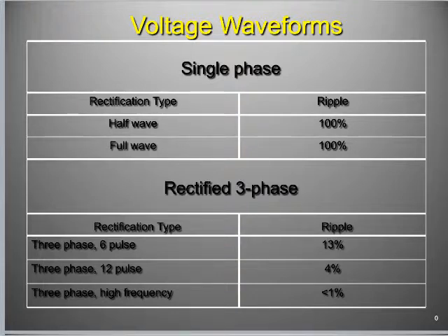There's some stuff we should underline here on page 122. We have a direct current waveform that I always imagine like a butte in Utah, right? Just like a cliff or something, like the thing from Close Encounters of the Third Kind. Versus alternating current is this wavy thing. That's what I mean by waveform. It's a wave, right? And there's some important stuff here about this wave.